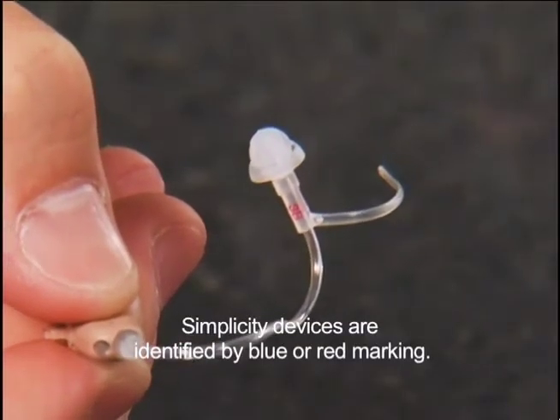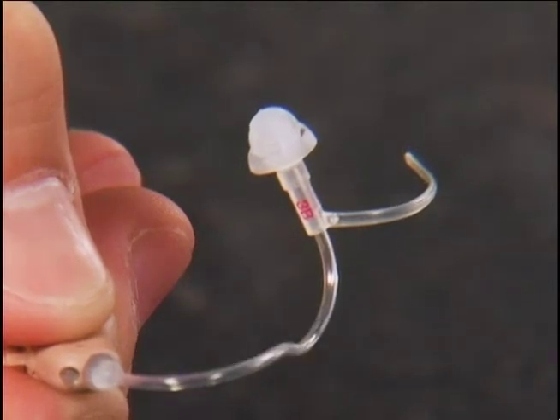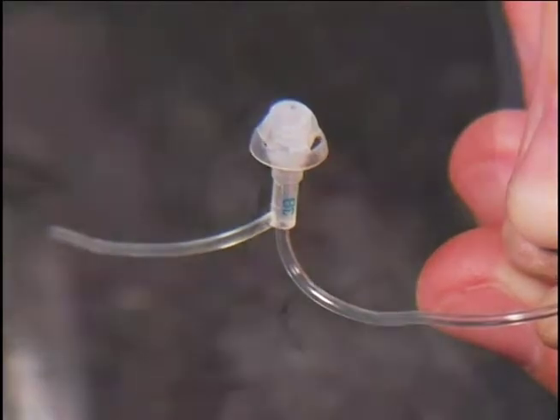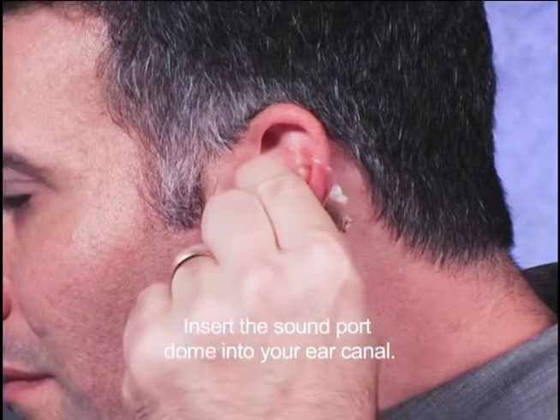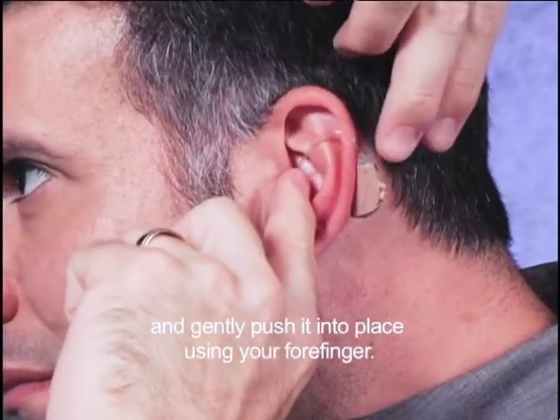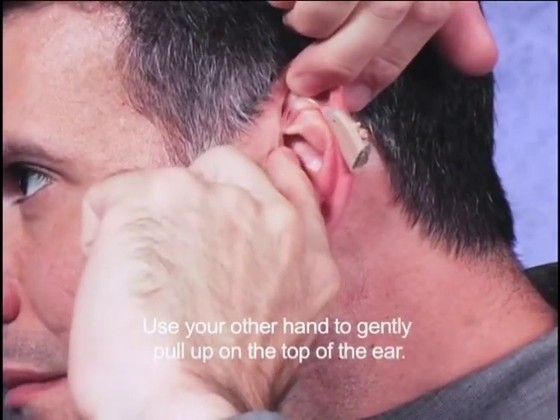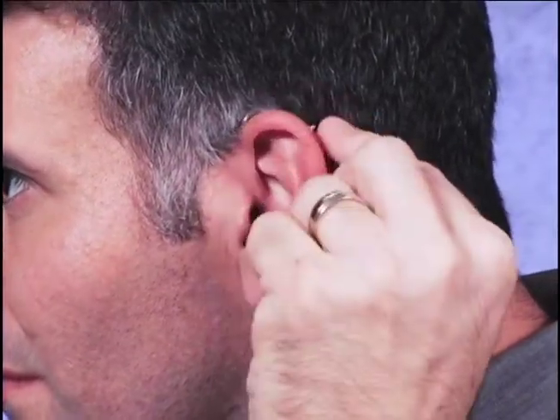Each device is identified by either a blue or red colored mark at the base of the sound port. Red is for the right ear and blue is for the left. With the sound port dome pointed towards your ear canal, insert the sound port dome into your ear canal and gently push it into place using your forefinger. You may need to use your other hand to gently pull the top of your ear while doing this.